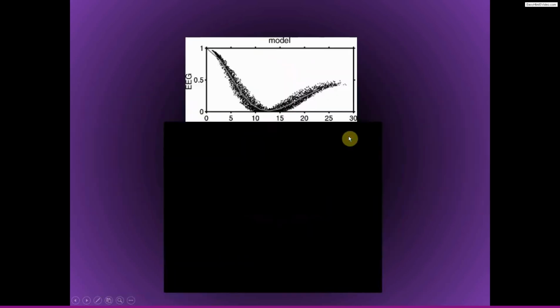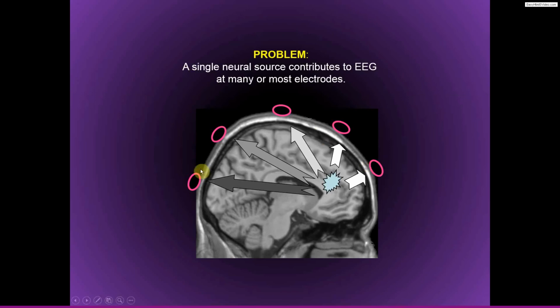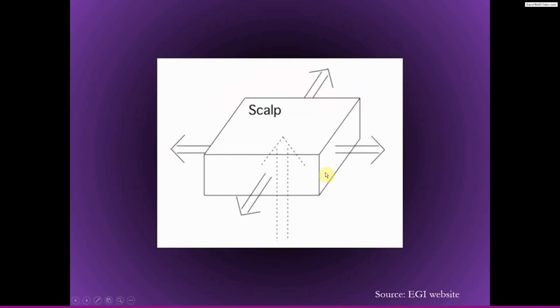What they're showing here, in simulated data, is inter-electrode distance: the apparent connectivity between those two electrodes increases with decreasing distance between them. Here they show a sort of resurgence. You don't see this in real data, but this is just simulating that you get to the other side of the dipole when you get far enough away.